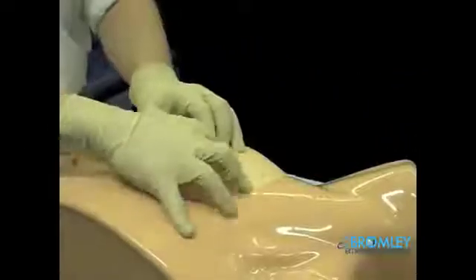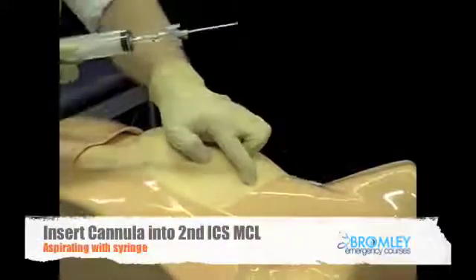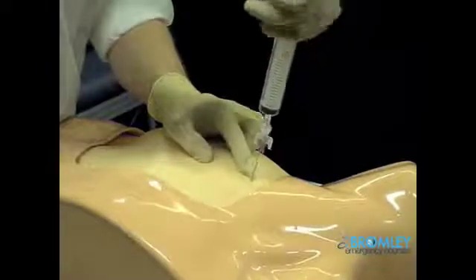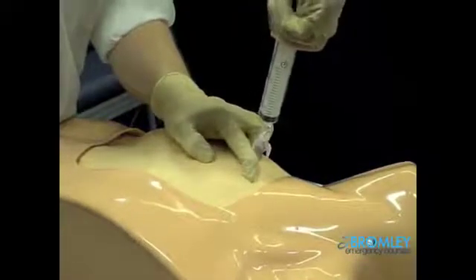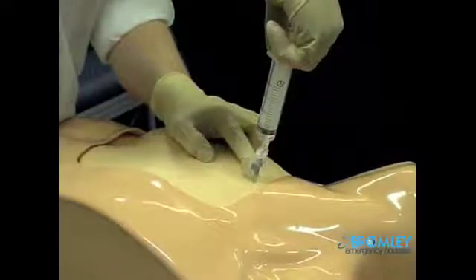Having given your local anaesthetic a good period of time to take effect, re-identify your anatomy and insert a large bore cannula into the second intercostal space, mid-clavicular line. When the cannula is in the correct location, air will be able to be aspirated freely.